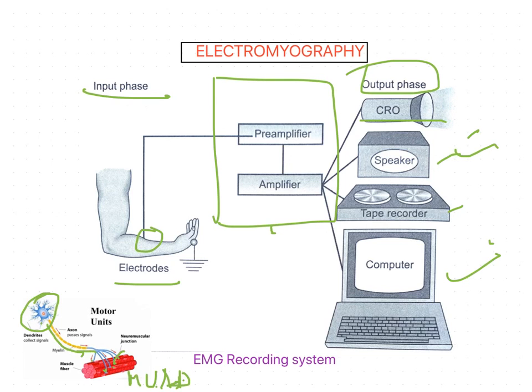The electrical disturbance recorded is the sum of the potentials due to all the muscle fibers in the motor unit. For any study, the number of electrodes required is three. Even if you take needle electrodes only, we require 3 electrodes.